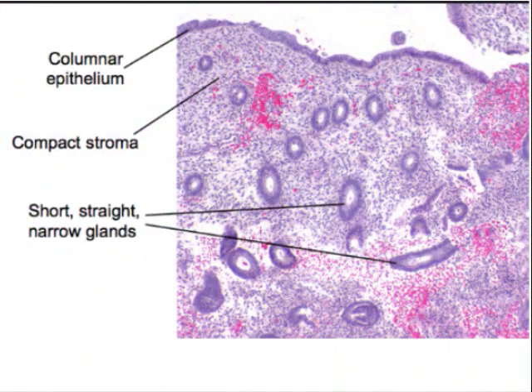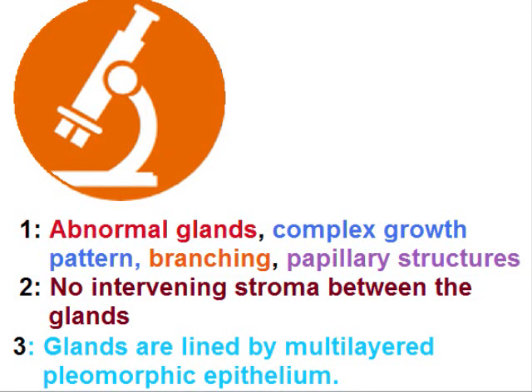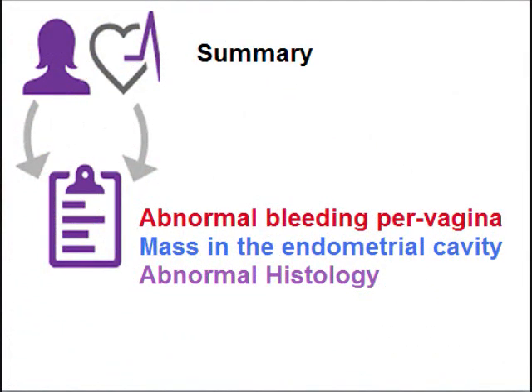For comparison, normal endometrium shows abundant stroma with few glands that are regular and round in shape, lined by normal epithelium. To summarize the microscopic features of endometrial carcinoma: abnormal glands with a complex growth pattern, branching papillary structures, no intervening stroma between the glands, and glands lined by pleomorphic epithelium.